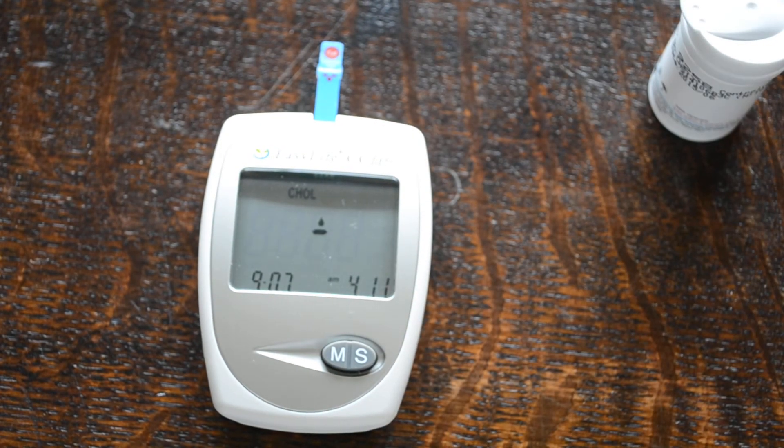So that's the EasyLife triple meter demonstration of how to perform and set up ready to do a cholesterol blood test.